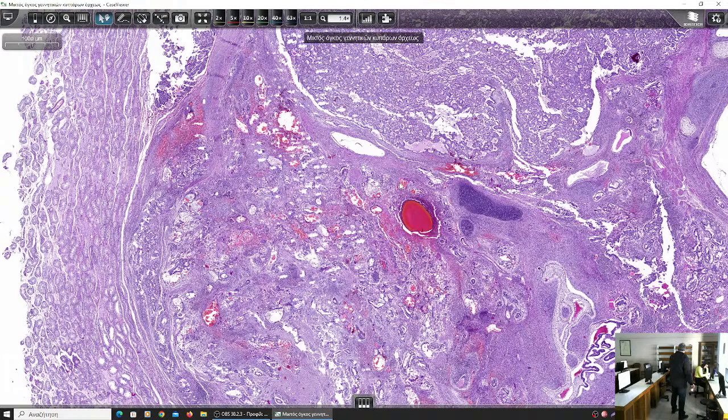So a choriocarcinoma, as a rule, has both cell types, syncytiotrophoblastic and cytotrophoblastic, and the levels of the secreted human chorionic gonadotropin from the tumor are in the class of 50,000, 100,000.